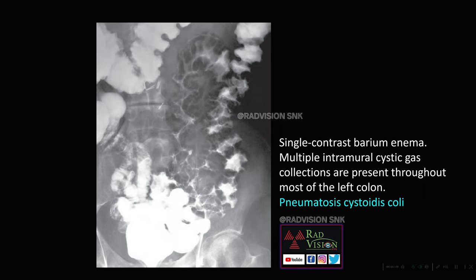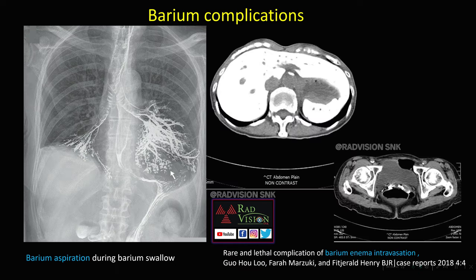Here on single contrast barium enema you can see multiple intramural cystic gas collections in the left half of the colon. Whenever you see multiple intramural cystic gas collections or filling defects in the colon, definitely suspect pneumatosis cystoides coli — a condition where multiple intramural cystic gas collections are seen throughout the colon.